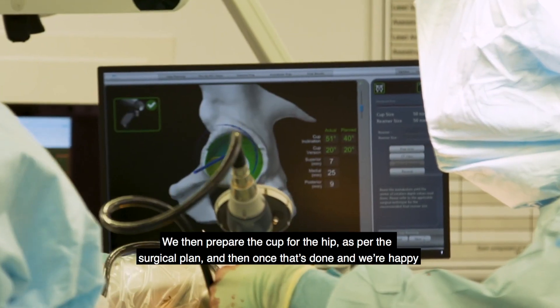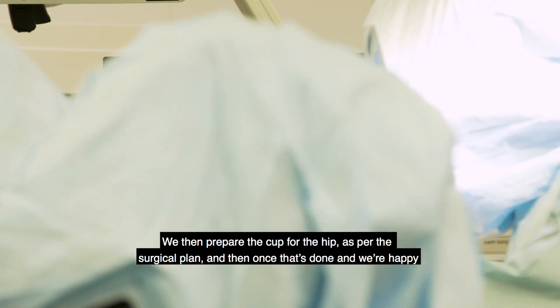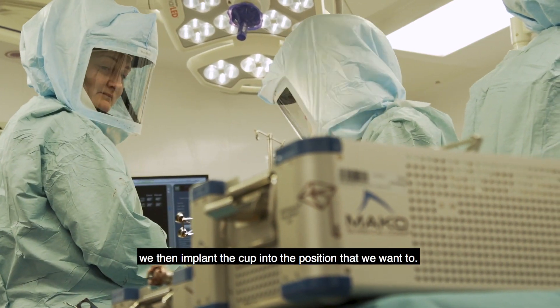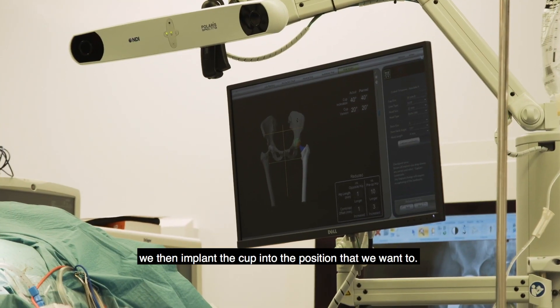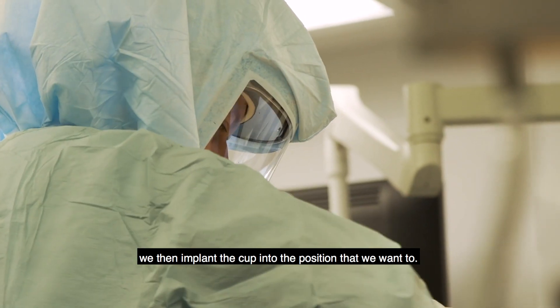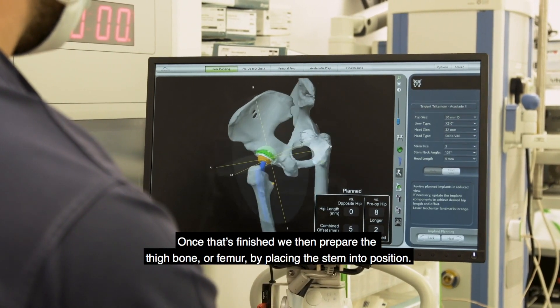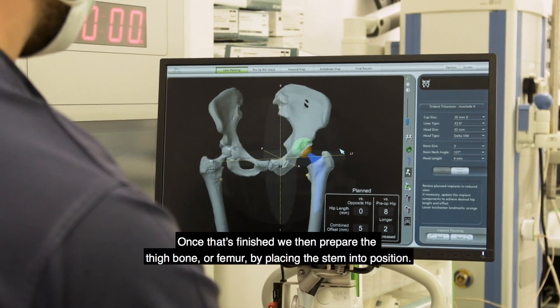We then prepare the cup for the hip as per the surgical plan, and once that's done and we're happy we then implant the cup into the position that we want. Once that's finished we then prepare the thigh bone, or the femur, by placing the stem into position.